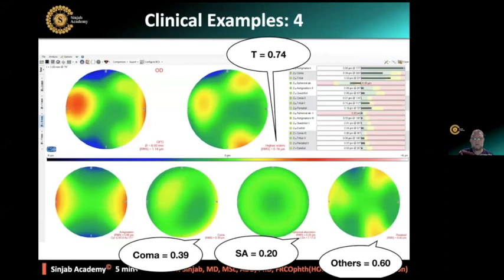This is an example. This is not from the Pentacam. It is from Cyrus. It gives the numbers in a different way. So it gives the total, okay, but all total, not for the 5. This is the problem with the Cyrus. You cannot select, okay? In Galilei and Pentacam, you can select only the 5. Here, it gives everything all together. This is why I raised the threshold a little bit in the Cyrus.